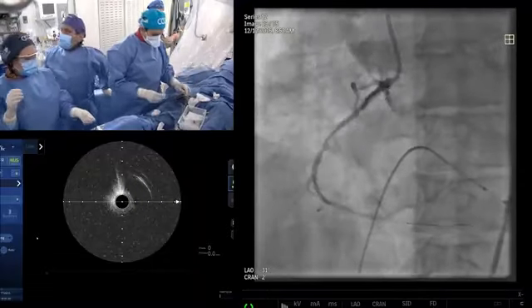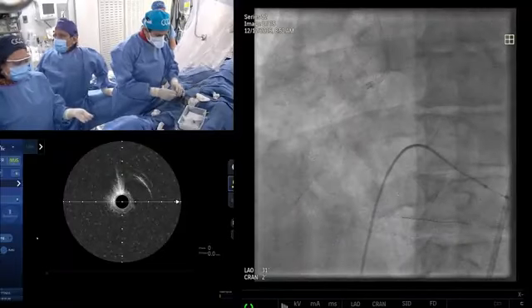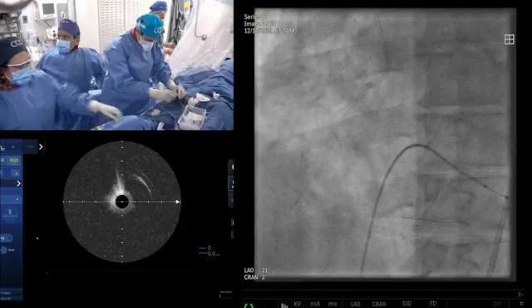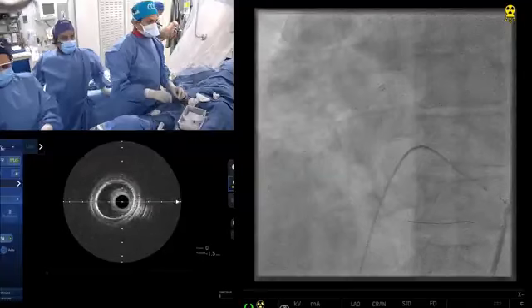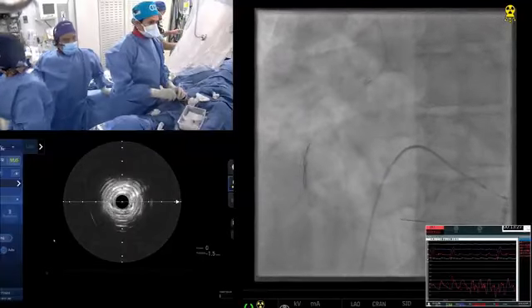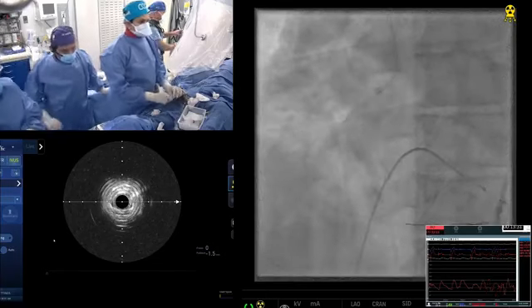There's still some ST elevation you can see. Guys, continue to show the hemodynamics on one side. There's a little bit of ST which is expected with such a calcific lesion. And now we are ready to do the IVUS. Yeah, good. Yeah. Remove the rotor.